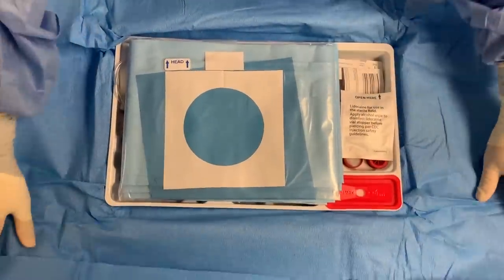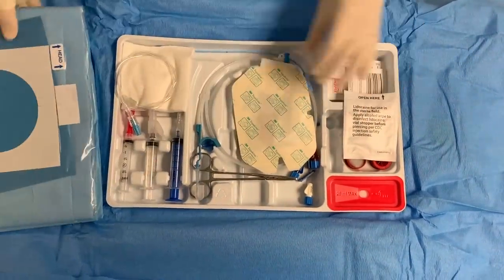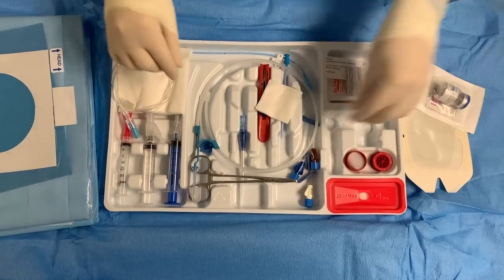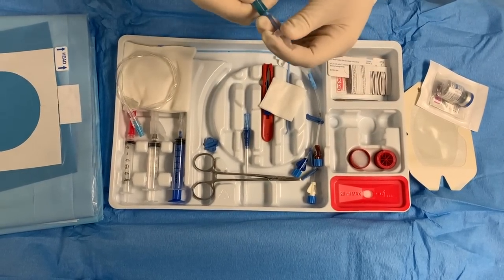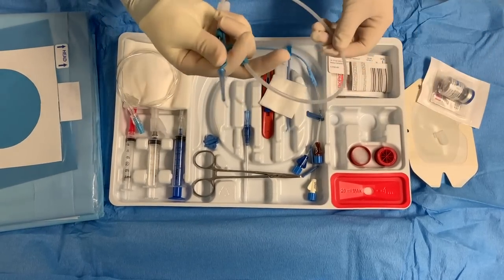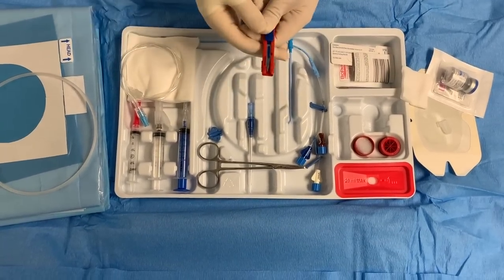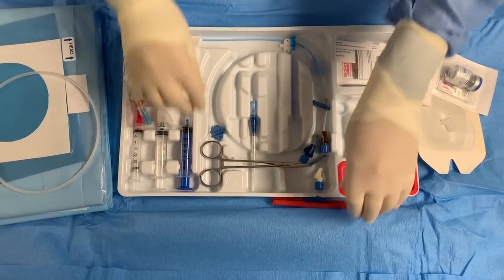This is our kit. You guys can come closer so you can watch. This is what's going to go on the patient. You always want to check all your equipment. This is going to be your guide wire — thread it in a little and take the top one out. You can see that this is your guide wire. Always want to double check your blade and make sure your blade works.